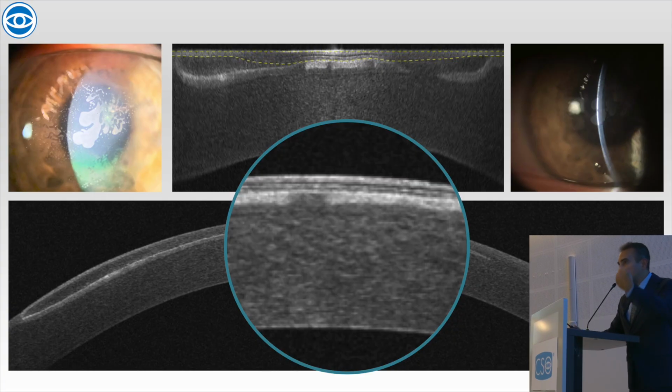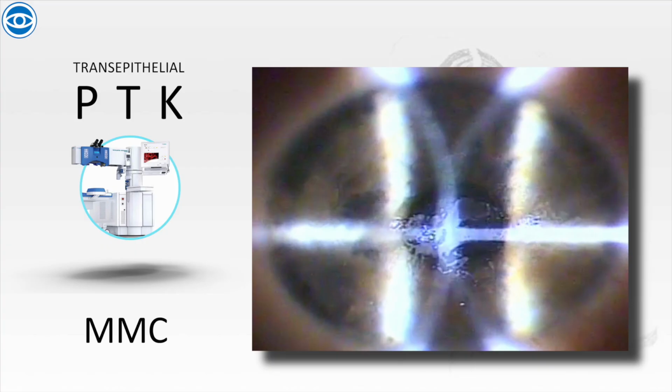So instead of relifting the flap, only discovering there's nothing, and only then inviting more epithelial ingrowth by relifting another flap another time, basically, I did a transepithelial PTK combined with mitomycin C. And that's the case right under the laser, and 6 months out, the cornea is pristine centrally and peripherally. So completely a change of decision.